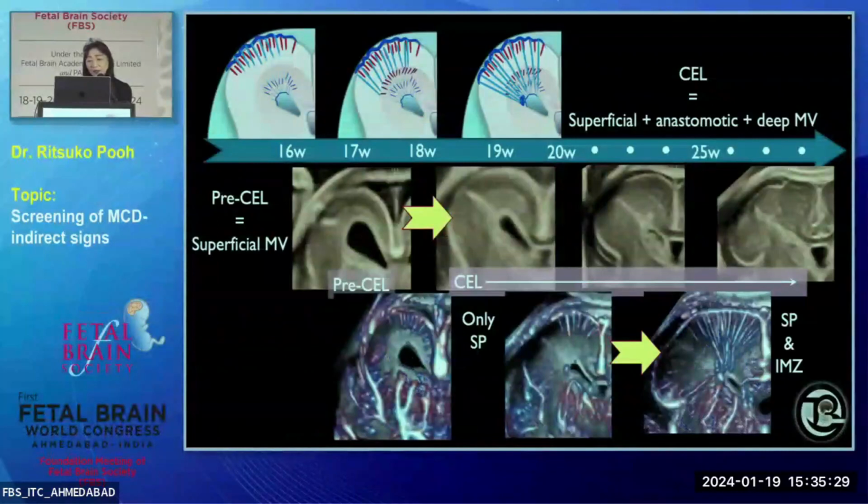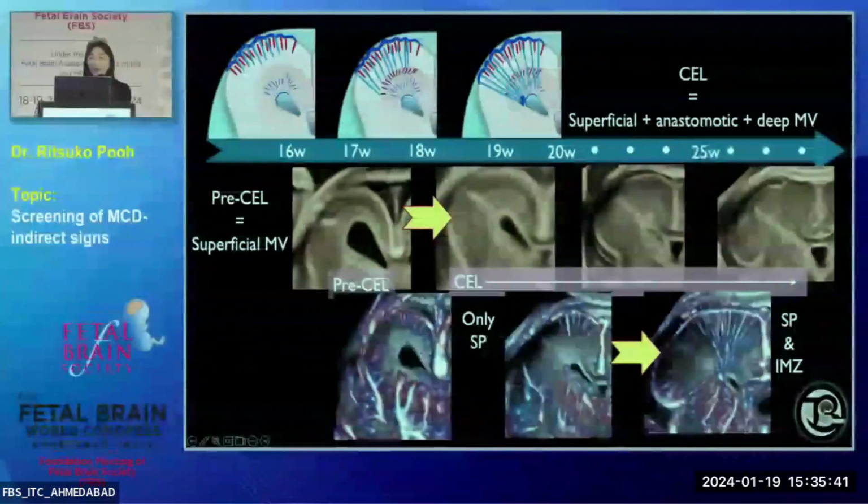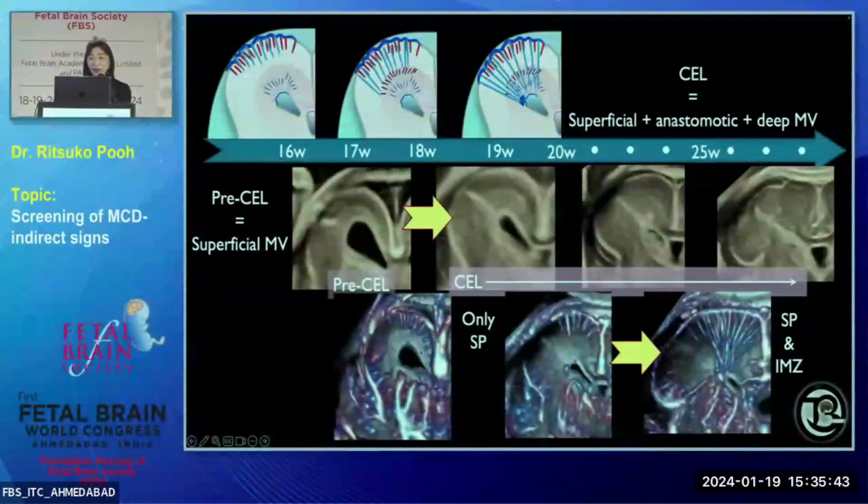Most probably, this delay may be due to the limitation of Doppler resolution. The deep medullary vein is super small and super slow. Therefore, even with slow flow Doppler imaging, that super slow flow cannot be detected. But it might be resolved in the future because of technical development.